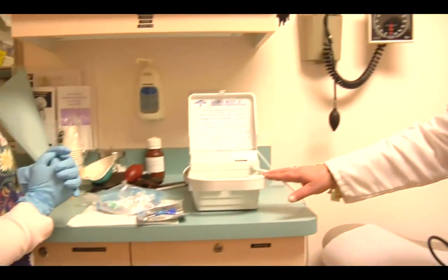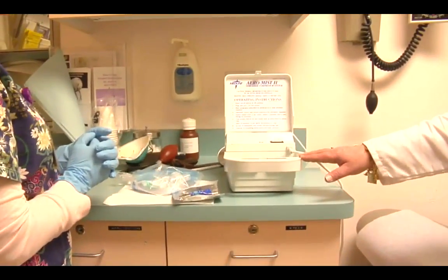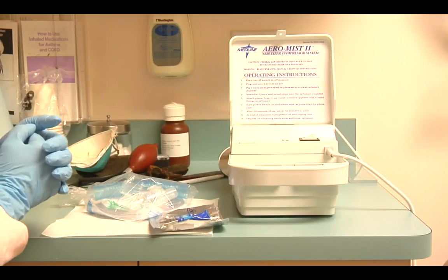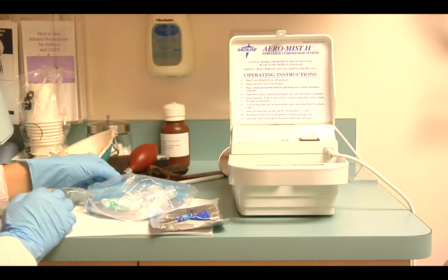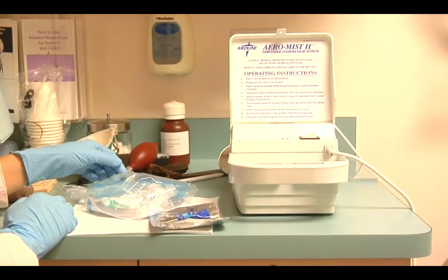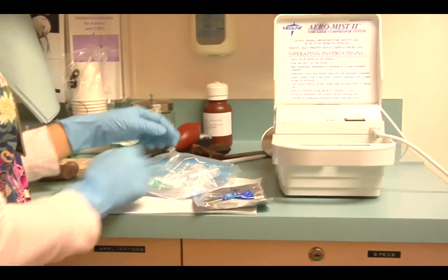This is the nebulizer machine that is available by prescription. We also use tubing, which does need to be cleaned on a regular basis. But we're starting with a new set of tubing, which we're going to open up the sack.